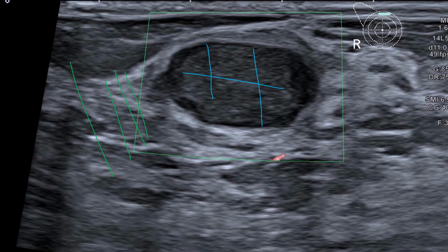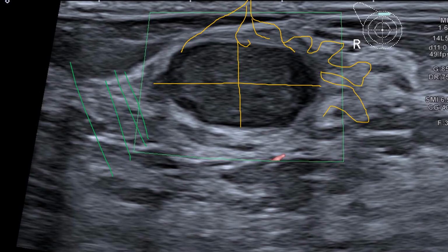When you are checking these lesions for cancer, you must compare if they are wider than they are tall. This is running along the grain, rather than being tall. Normally cancerous lesions are tall, they grow against the normal grain of the tissue. At the same time, they can be irregular with multiple angulations. So you can see a cancer developing like that.